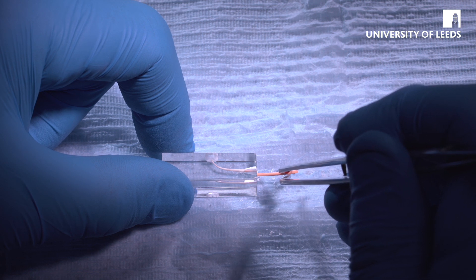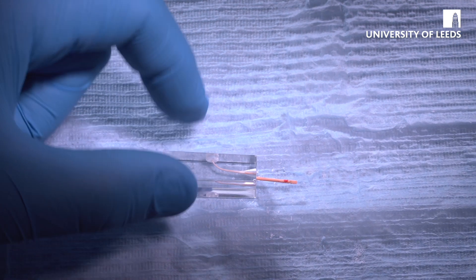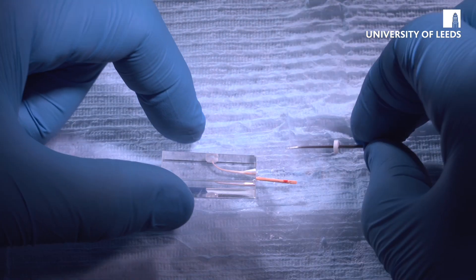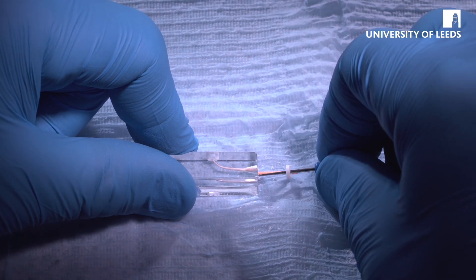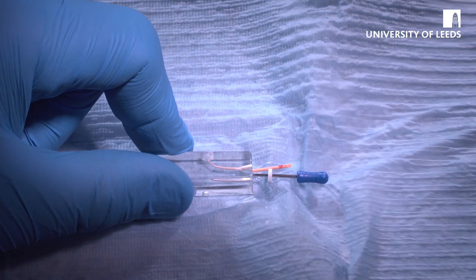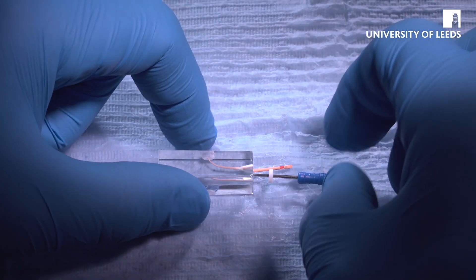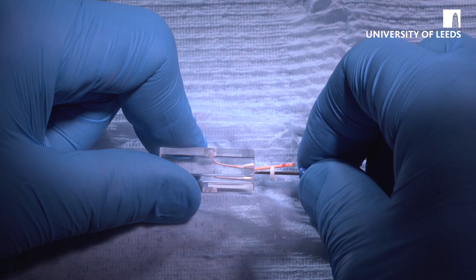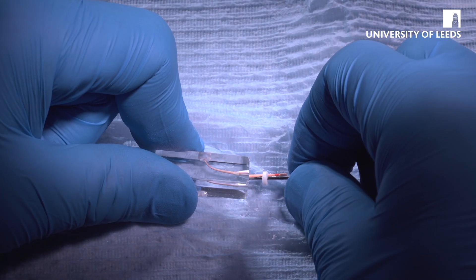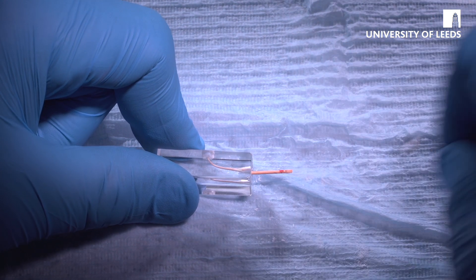Just gently pump it up and down to get the sealer to flow. Then take the finger spreader, apply it on the outside of the curve, and push down quite firmly. It won't go as far as it would have previously because obviously there's gutta-percha there now. Push it down, compress the gutta-percha, hold for two or three seconds, and then twist and release.